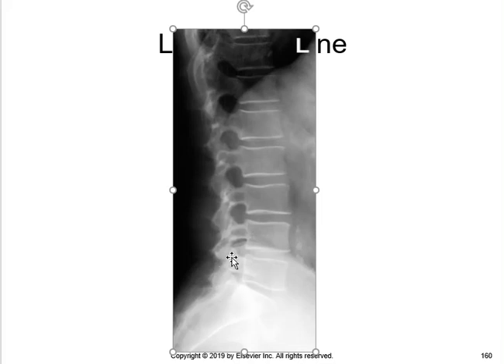But if you look at this density, this bright area right there, that's your iliac crest. And if you've got your patient truly lateral and they don't have any kind of rotation, then what you should see is the peak of that iliac crest being right around the middle of the vertebra. So we go straight up from this, and let's say we take this distance and flip it over. It's about the same distance between here and here as it is from here to here. So the highest point of your iliac crest is going to be right around the center of your L-spine.